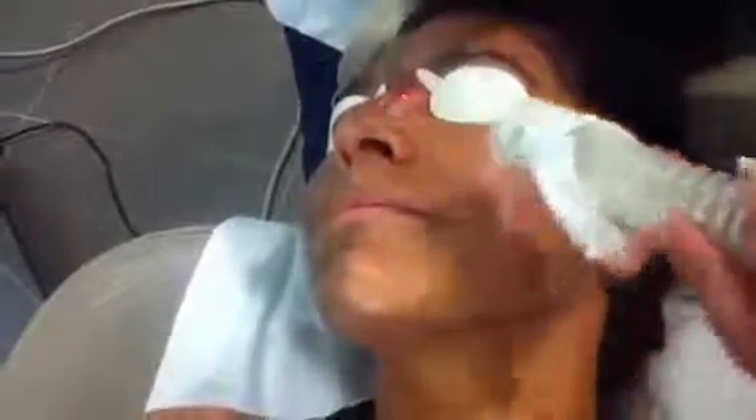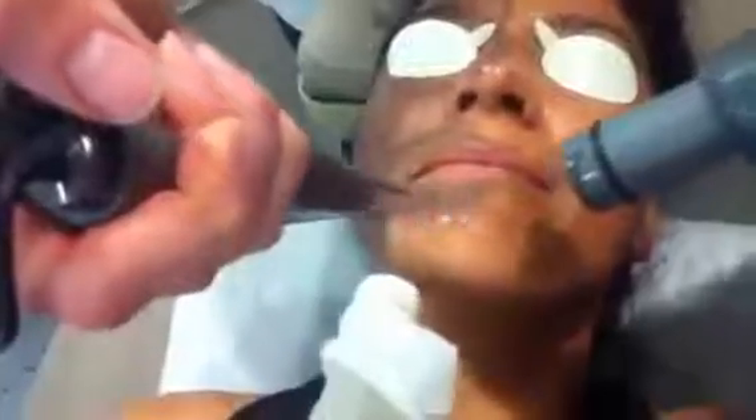We also use an evacuator because there's a little bit of carbon blasting off the surface of the skin. And to keep patients comfortable, we also go by with a little bit of cold air in order to make it really comfortable. This really isn't uncomfortable — the patient hasn't had any numbing. It feels almost like sand patterning or a little bit of pins and needles. The first pass is a little bit louder and spicier because we're taking off that carbon layer, but after that you really don't feel very much. By using the cold air, it really is a pretty comfortable procedure.